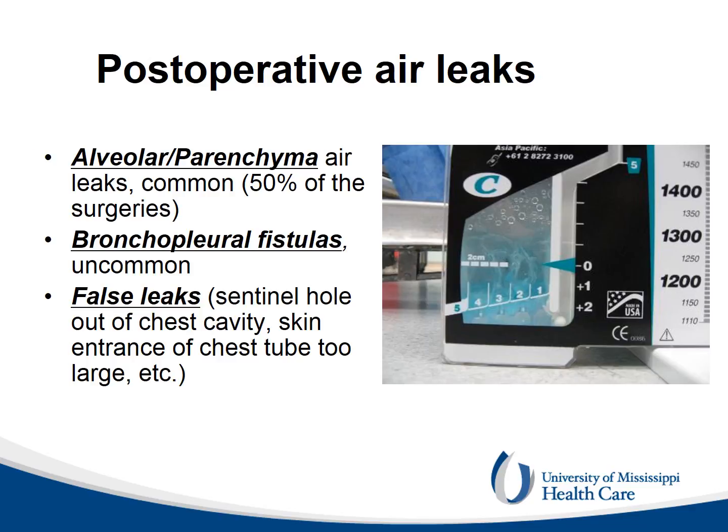A postoperative air leak is not uncommon after lung resections and is usually self-limiting when originating from the parenchyma. A large and persistent air leak may be due to the presence of a true bronchopleural fistula and may need revision of the bronchial closure. A system problem in the chest tube or the CDU needs to be ruled out before considering a reoperation.